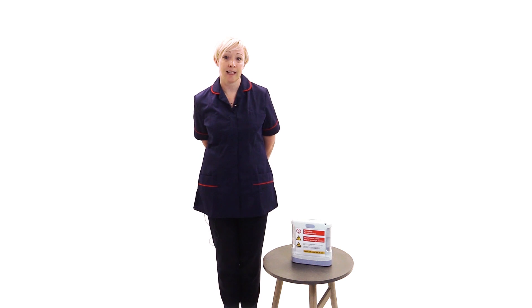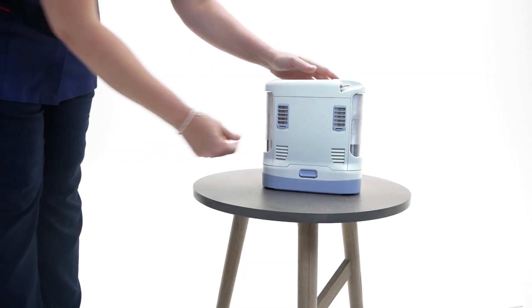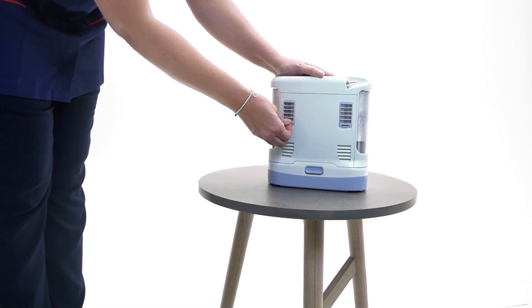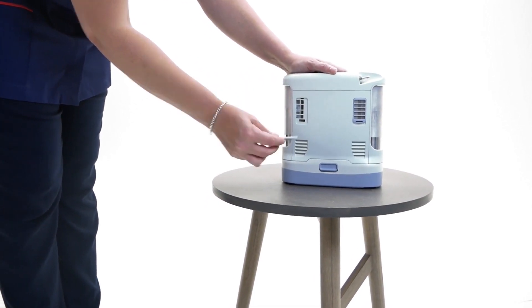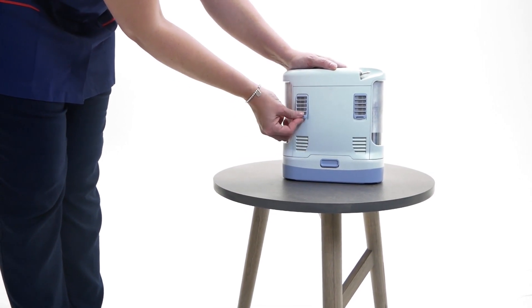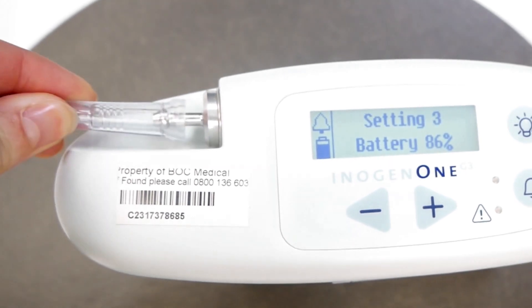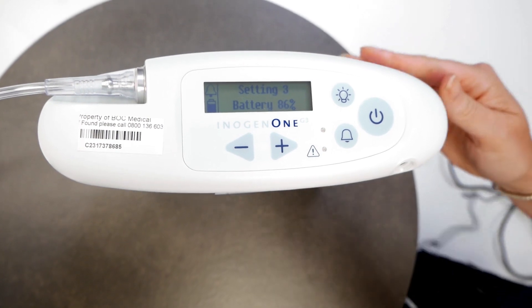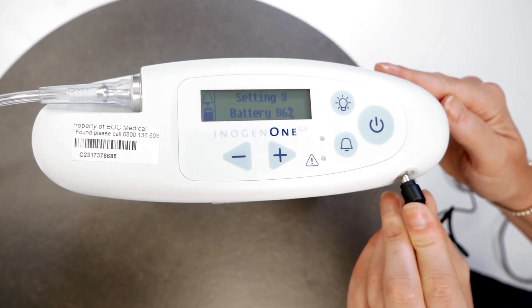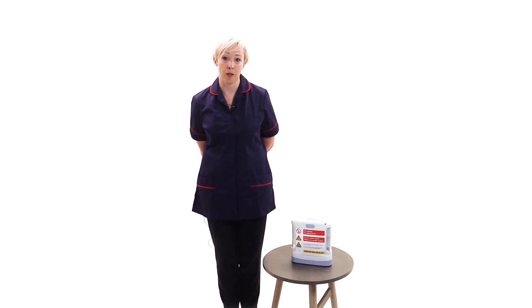We will now look at the filters and connections. The particle filters keep out dust, dirt and large particles. They must be kept in place during concentrator operation to keep input air clean. Your nasal cannula connects to the outlet for oxygen delivery. The power input is located at the top of the device to one side and is the connection for external power from the AC power supply or DC power cable.